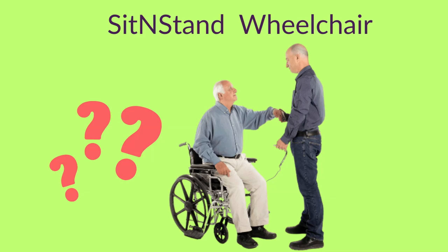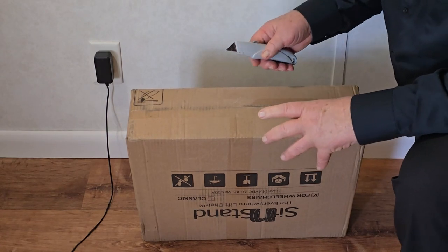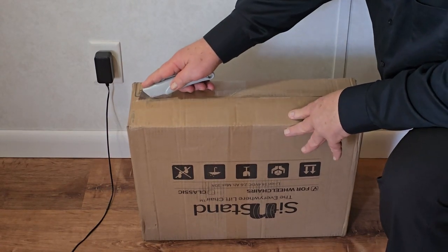What is a sit-and-stand wheelchair? In this video, we're going to unbox one of the inflatable seat risers.